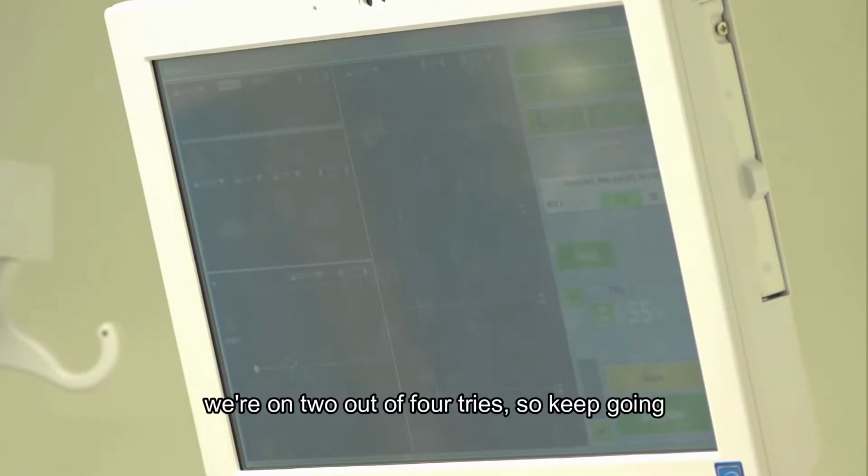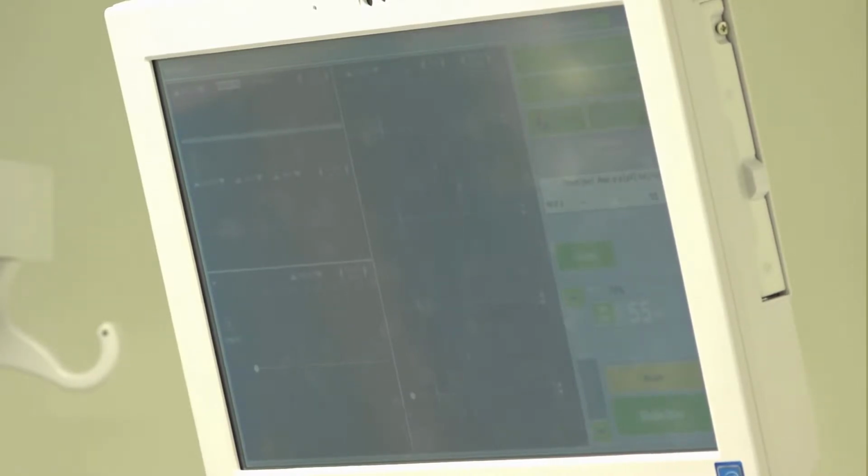We're on 2 out of 4 tries. So keep going. So that's 2 out of 8 tries. Keep going. 3 out of 9.